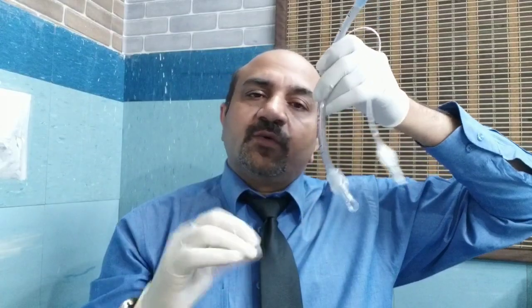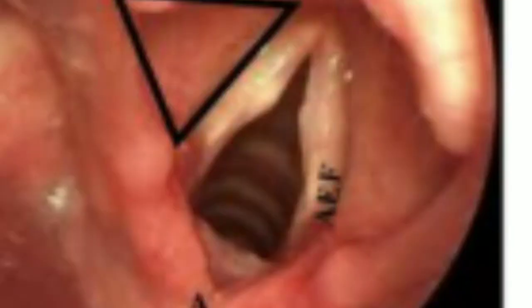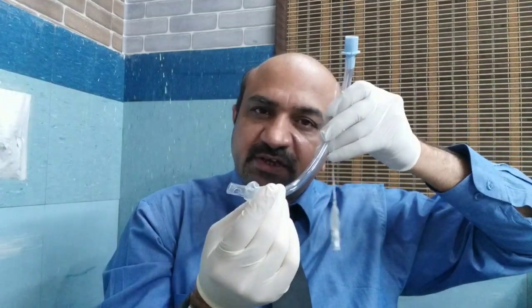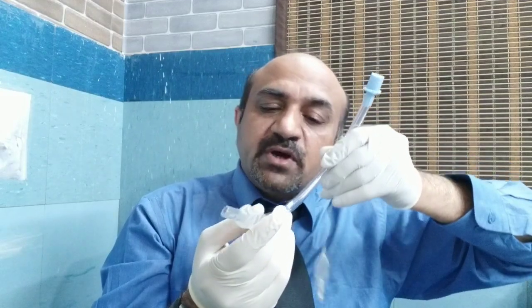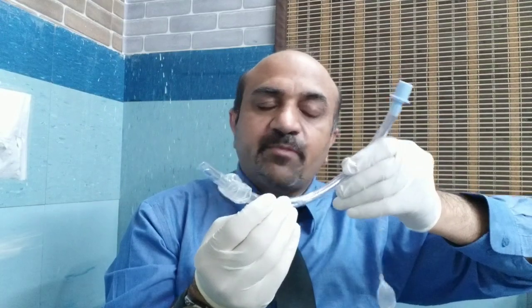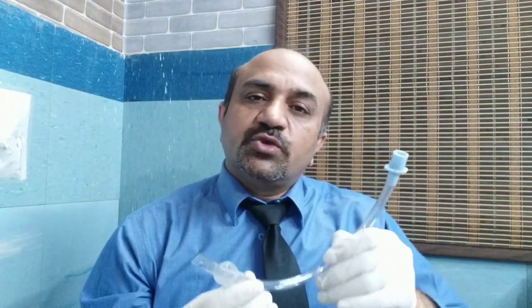Once you have passed the endotracheal tube, you pass it by looking at the opening of the trachea, and you need to enter the endotracheal tube while you are visually watching it. You will see that it is going inside the trachea past the vocal cords. Once it has gone past the vocal cords, you are in a safer zone to inflate the balloon, so try to note that part. This will help you fix the centimeter point at the incisor for each patient. So this is very important.